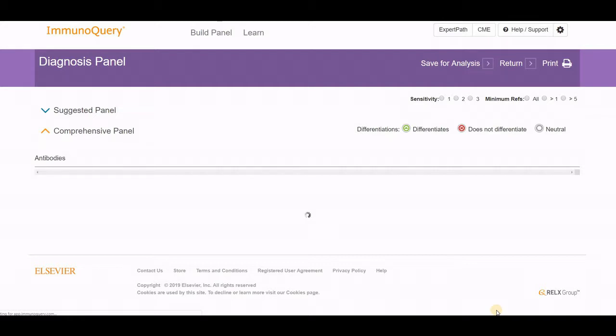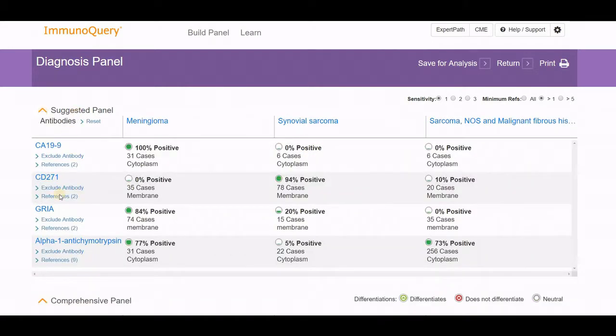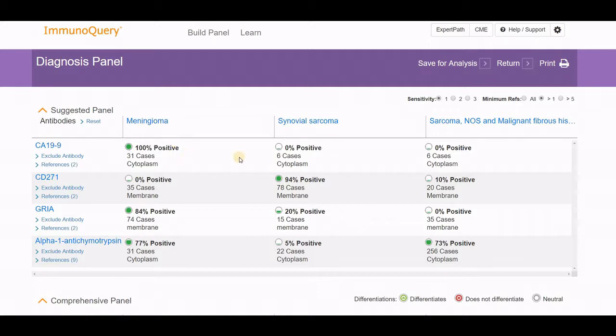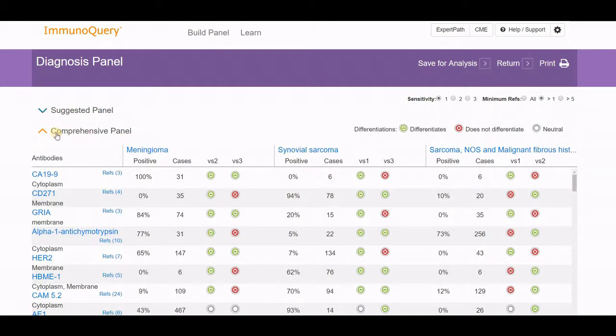Lo and behold, you will soon have all your results shown. It's divided into a suggested panel versus a comprehensive panel. If you click on the suggested panel, it brings it down to a small group of immunohistochemistry findings that may be of value. In this case, CA19-9 is present in 100% of cases of meningioma while absent in the other two lesions. So I would be able to separate it with at least one of those studies, with CD271 being present in synovial sarcoma while not positive in meningioma. These findings maximize both sensitivity and specificity, but you may not have these antibodies available.